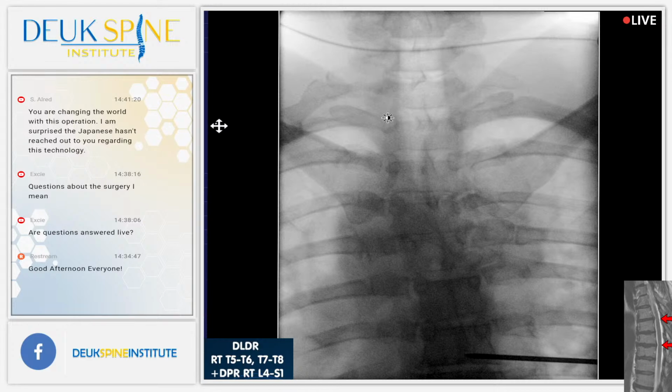So that's 1, 2, 3, 4, 5, 6, 7, 8. So if we count down from the neck, we're at 7, 8. And if we count up from the bottom, we're at 7, 8. So both ways we're coming up with 7, 8. All right, I like that. So let's come back to where I am, and let's use the bottom rib, 12, for the rest of the surgery, because I think it's going to make it a little easier with the fluoro.